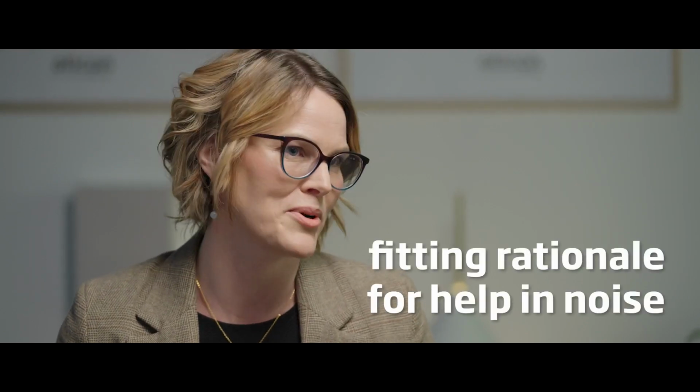So you have that starting point. But as it stands, we don't really have any guideline or directions from anywhere telling us how to help them in terms of the complex listening environments, hearing speech and noise. So with this, we give that direction, we give that prescription. And that's essentially, if you want to put it simply, a fitting rationale for help in noise.